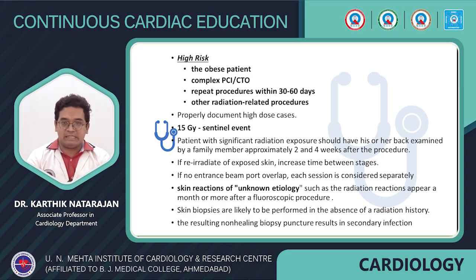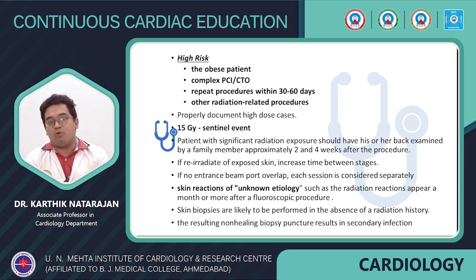And if you feel skin changes, then always tend to increase the time between the stages. And if there is no entrance beam port overlap, each session should be considered separately. And sometimes you can have unknown etiology skin reactions, and skin biopsies are likely to be performed in the absence of a radiation history. And these biopsies would in turn result in secondary infections.